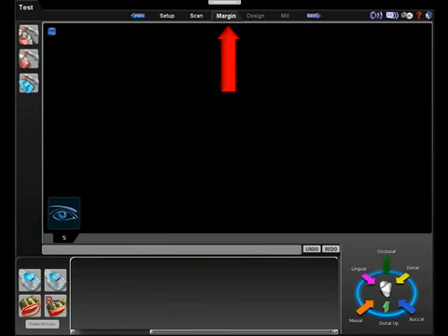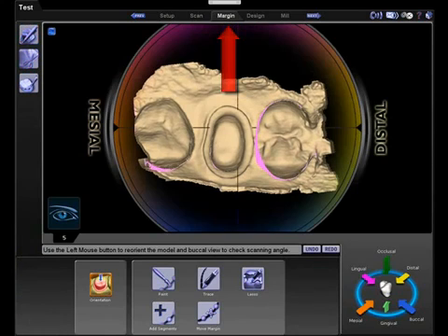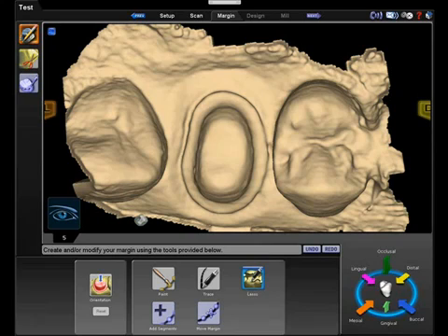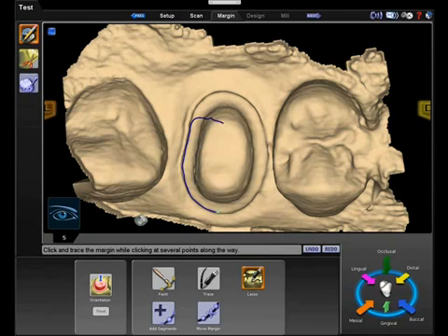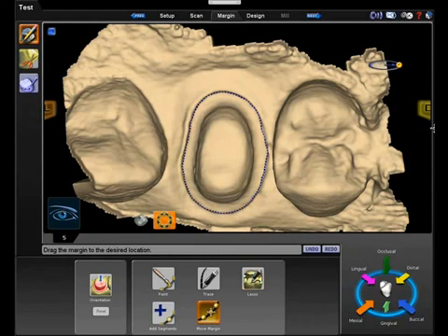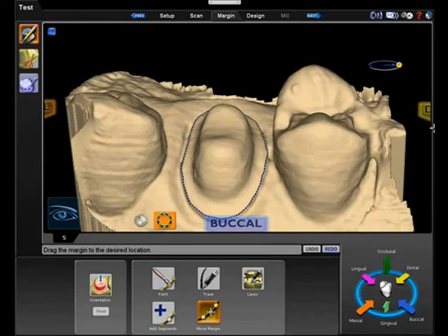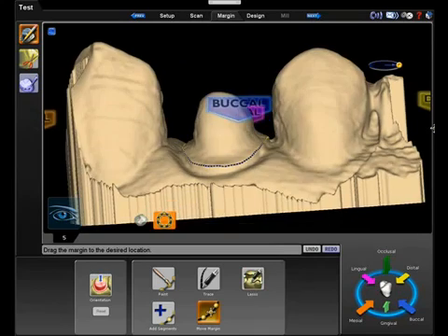Next we proceed to the margin tab. Here we set the orientation of the model to ensure that the mesial and distal, buccal and lingual of the preparation are all in good alignment. This will aid in the autogenesis, which is our automatic design of the restoration. Draw the margin and evaluate for any needed adjustments.